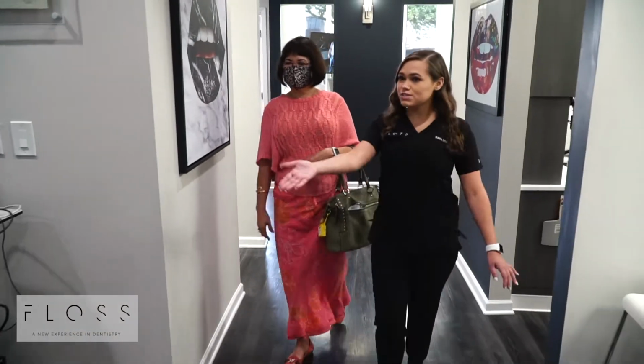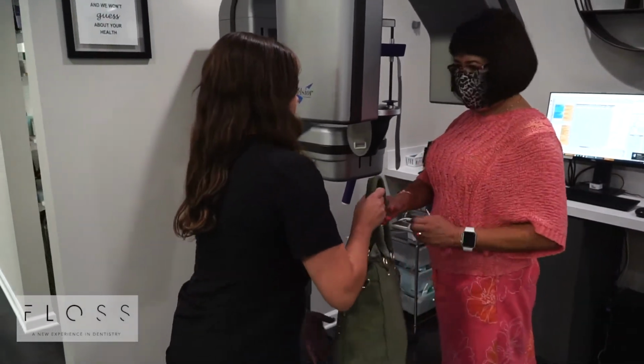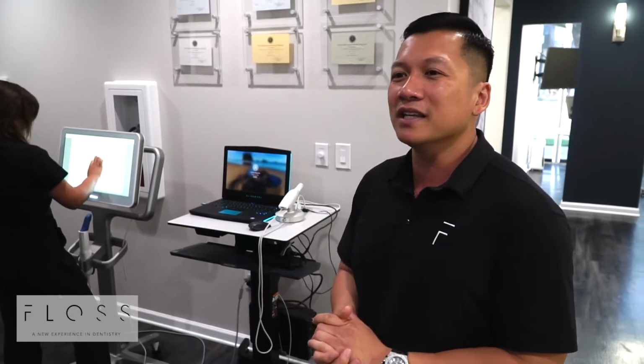All right, so let me give you a tour of the office. So we have 8 operatories here. When the patient comes in, we're going to bring them in to get a 3D x-ray, and that's our unit here. That's going to give a whole view of their mouth, a lot of detail, so we can digitally plan the implants. And then right here, we have our digital intraoral scanner. When we take an impression, it's like a video camera of your mouth. You're not going to have that goo in your mouth like in the old days.